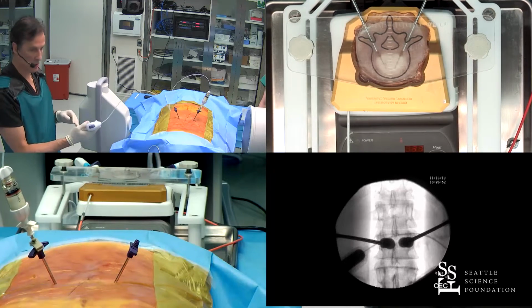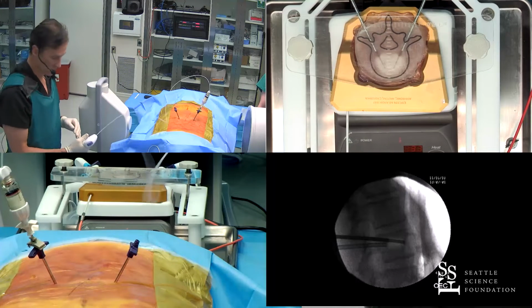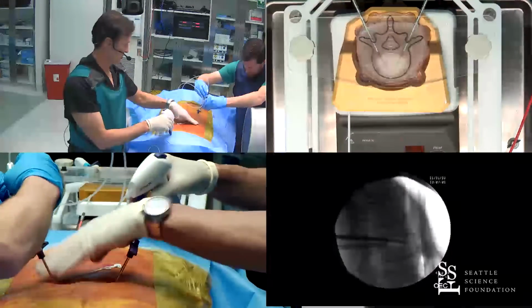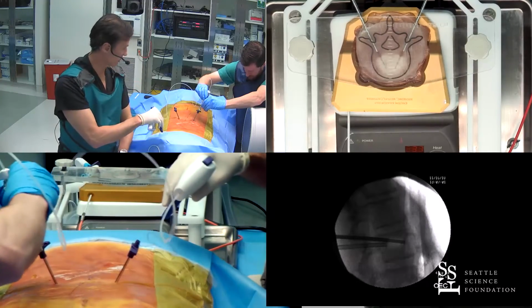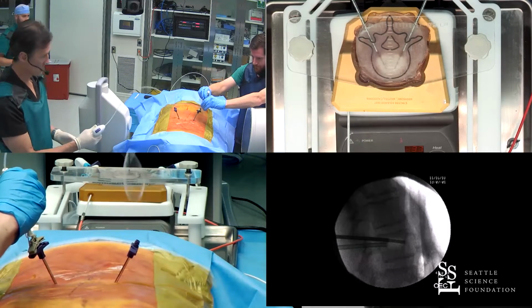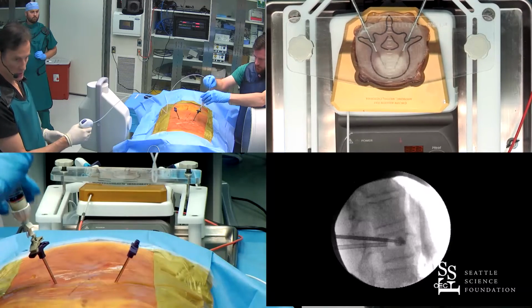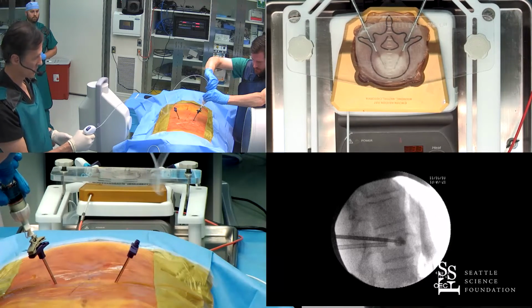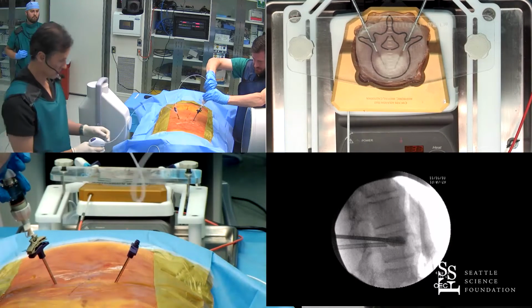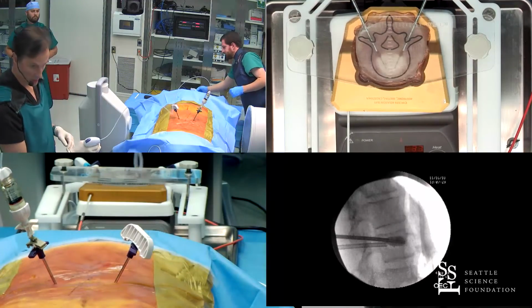This is designed for the gun to be delivered outside the beam so you can stand away while you're delivering it. And repetitive triggering will build up pressure. So build up a little pressure, and this is the quick release valve that you can access using your thumb. Perfect. So be able to cement nicely. And always keep in mind that you have to have something on the other side or it will come out the other needle.